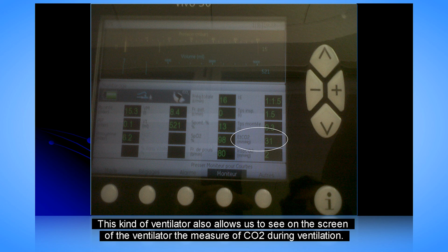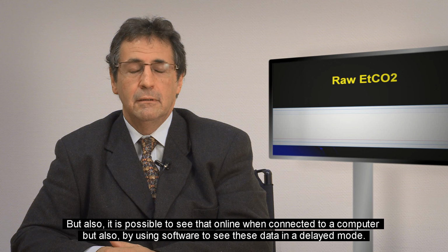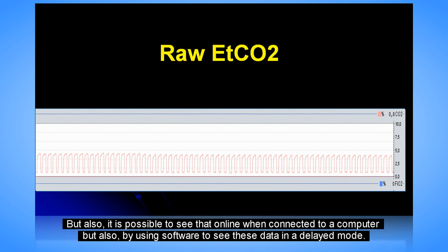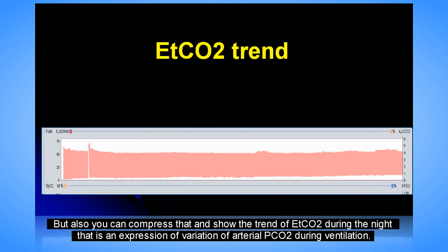This kind of ventilator allows also to see in the screen of the ventilator the measure of CO2 during ventilation. But also it is possible to see that in an online connected computer, but also using a software to see this data in a delayed mode. As you can see here, you have a screen capture of software of one of these ventilators that show a very beautiful end-tidal CO2 curve. But also you can compress that and show the trend of end-tidal CO2 during the night. That is an expression of variation of arterial PCO2 under ventilation.